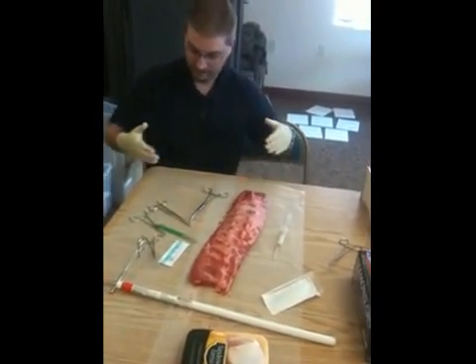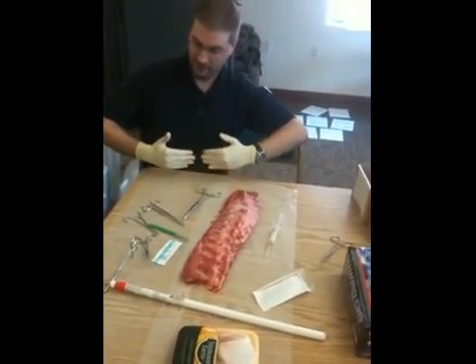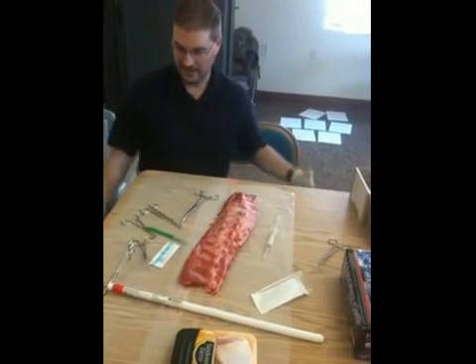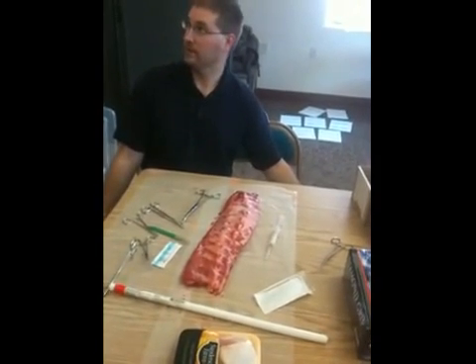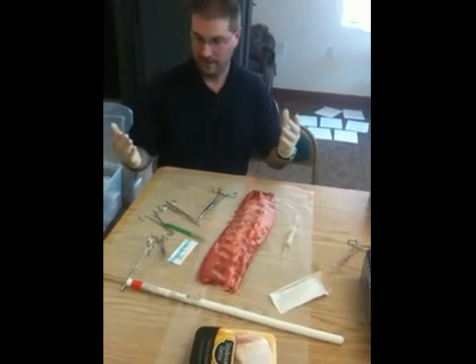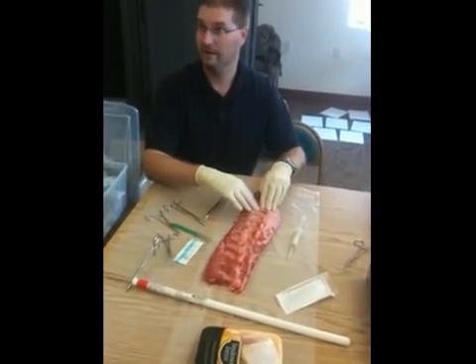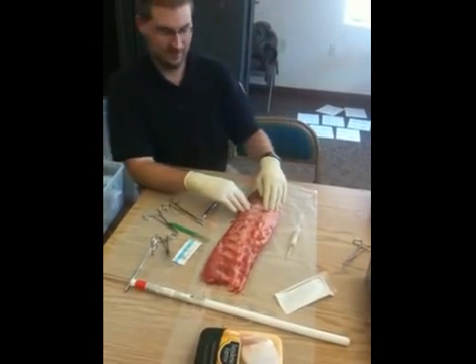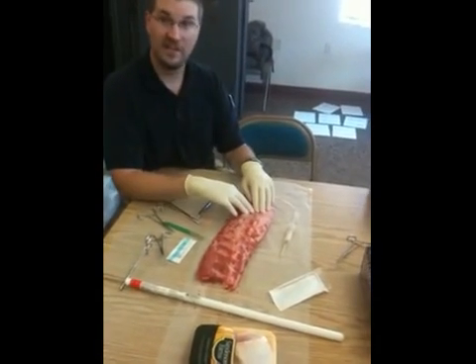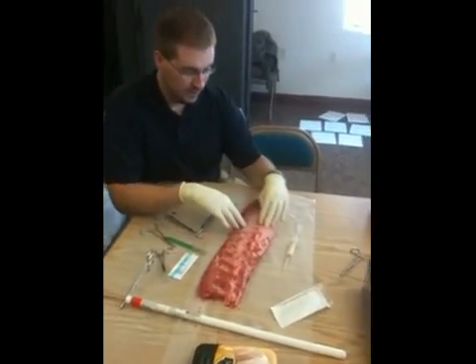We talk about the two inches around. Two inches in is considered dirty; this is considered clean. If my hands go below my waist, that's dirty. You want good technique. I know a lot of people say, "I don't care, it's dirty trauma." That's a bad excuse — there's no excuse for that. Because this is not necessarily an emergency procedure.